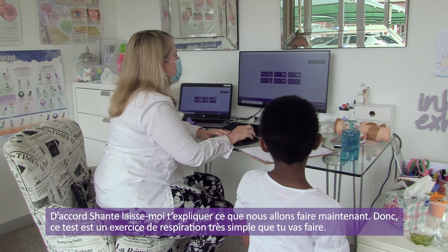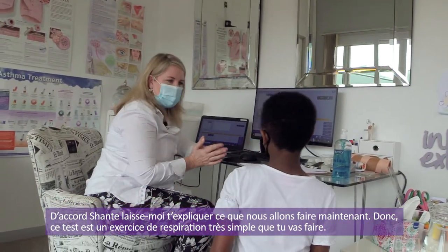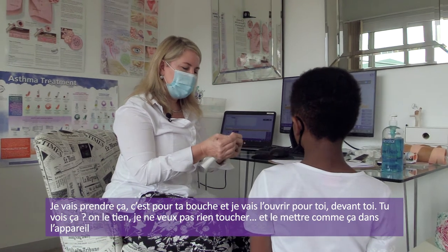All right, Shanti, let me explain to you what we're going to do now. So this test is a very simple breathing exercise that you're going to do. So what I'm going to do is I'm going to take this mouthpiece and I'm going to open it for you in front of you.